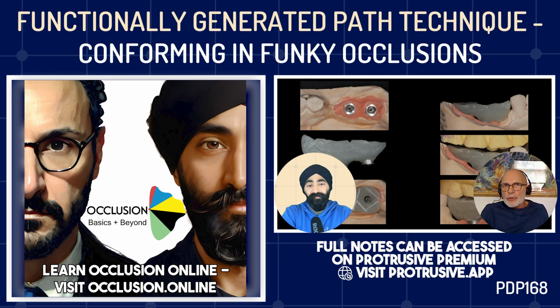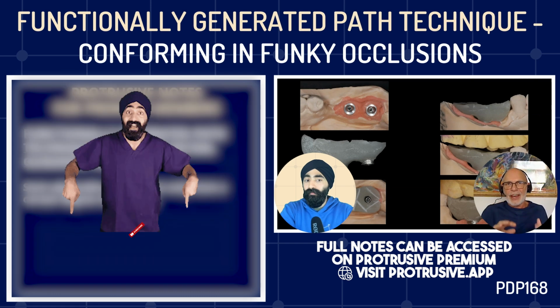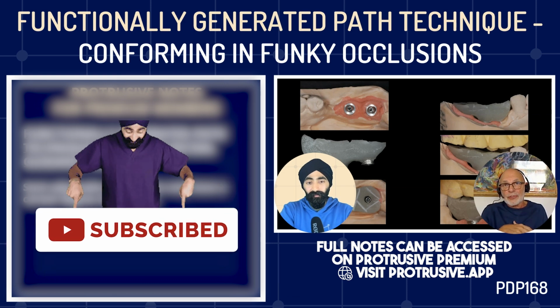I haven't used ModJaw. I know it's very expensive, but I think what's interesting even about ModJaw is that if you're trying to articulate models, for example, at an open vertical dimension, to the best of my understanding, there isn't actually a face bow that goes with ModJaw. You actually have to scan with your occlusion already open, and that's how they get the degree of accuracy that they want.